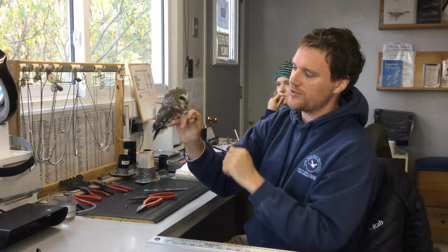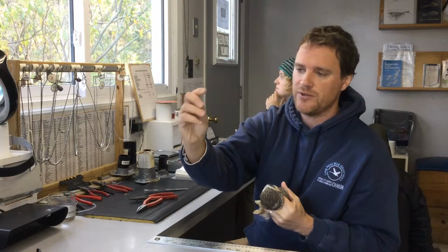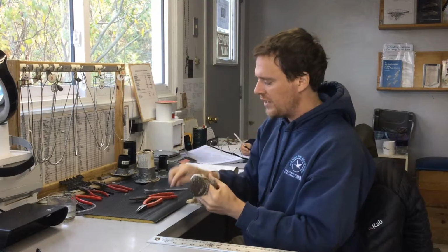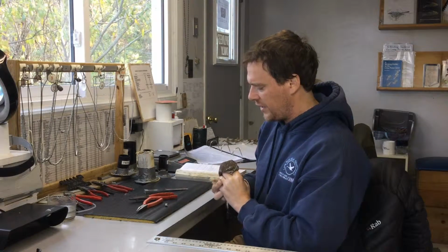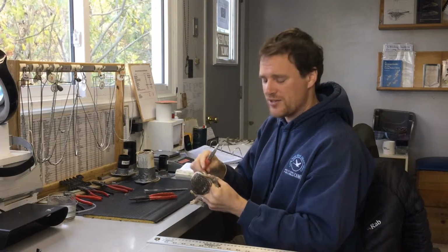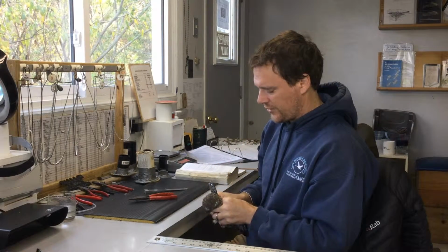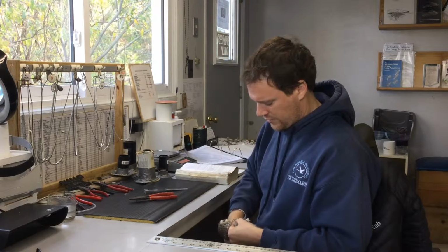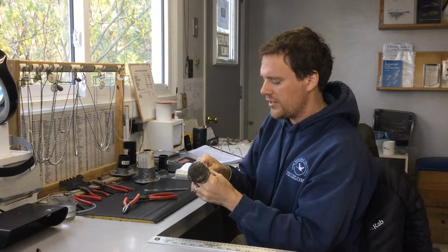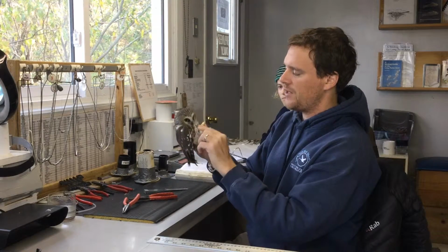So the first thing we're going to do with this little saw-whet owl is we're going to put a band on the bird. And this is the bands that we use. They all have a unique number, and they'll have a return address or a web address on the inside. And what we'll do with these birds is we'll put a band on first. The band doesn't hurt the bird. It fits like a bracelet. It's not going to slide off the foot. You use these special pliers here to put the band on. I'm gently going to support the leg and close the band around its leg like this. Once it's on, give it a bit of a twist, and we are good. All right.